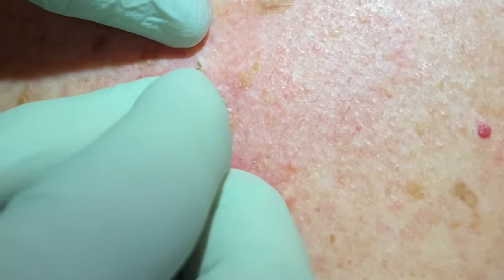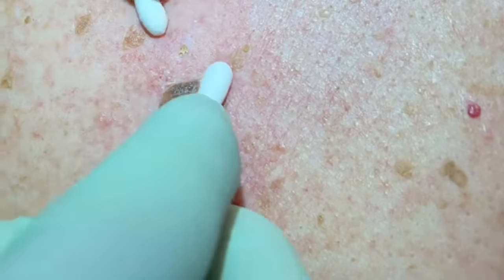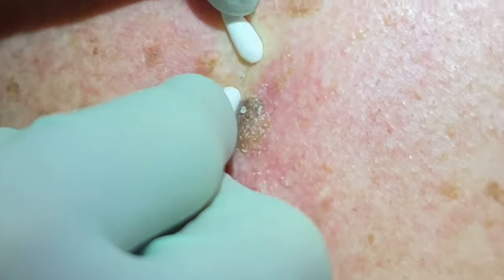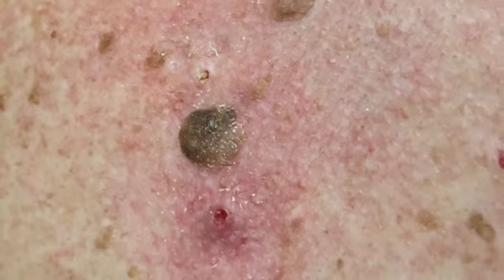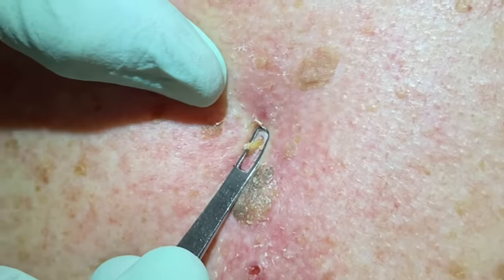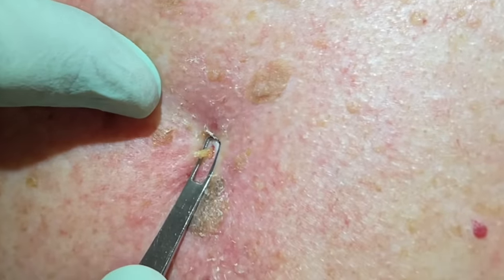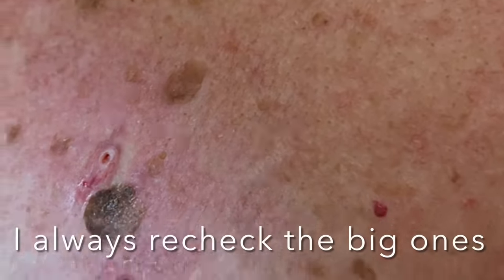Getting under that skin — there we go — it's starting to come out. You really have to tease these out; it's like a little plug. When the q-tips aren't working, we come in with direct pressure from the extractor. Sometimes the extractor is the better tool, sometimes the q-tip is. As he just told me, Q stands for quality — quality tips! That's a nice plug, pretty deep one right there.